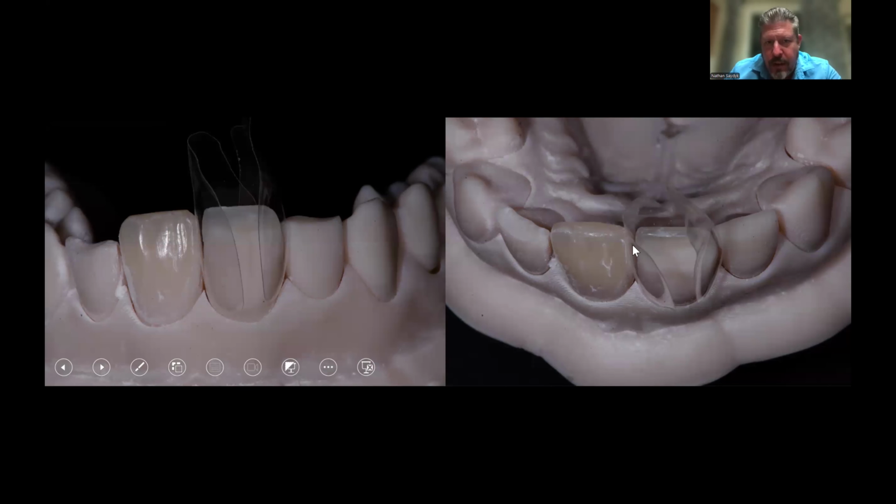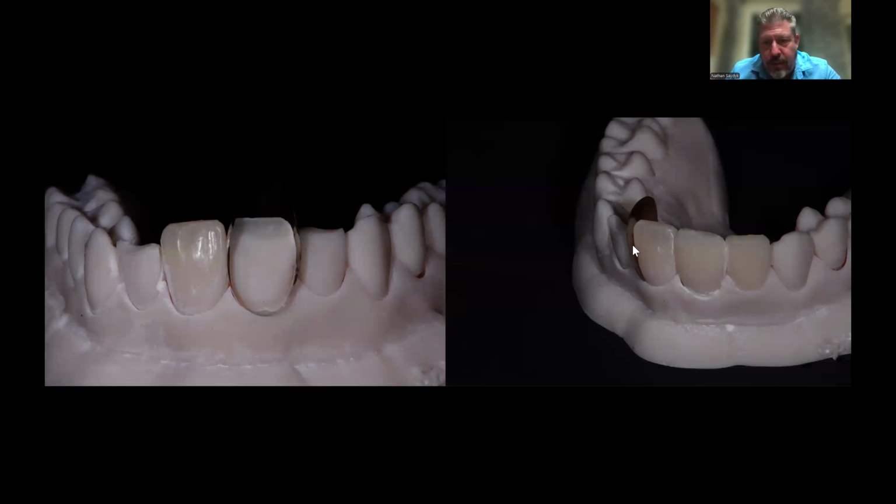The BioClear slips down and I can now bulk fill the mesial and distal, right? The Unica band works similarly like this, where I can wrap it around that tooth and I can get the mesial and distal and even build up the facial with this. You can also just use a little Paladint and slide it in between the teeth and get that shape. You don't want to use a flat matrix band because you're not going to get the contours you want.